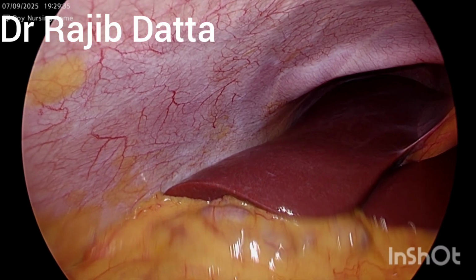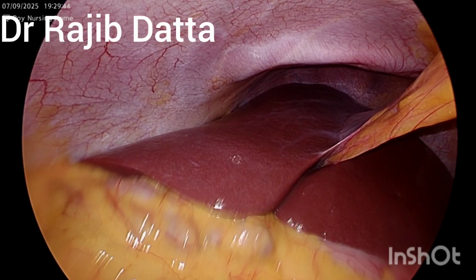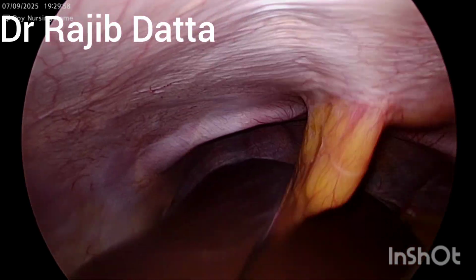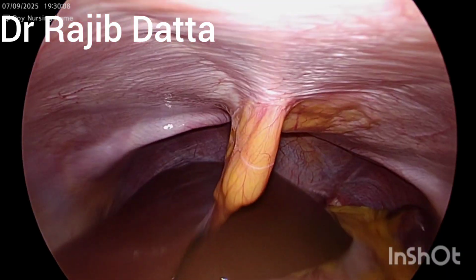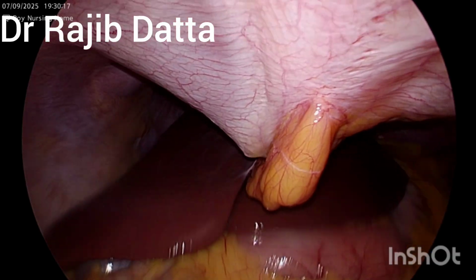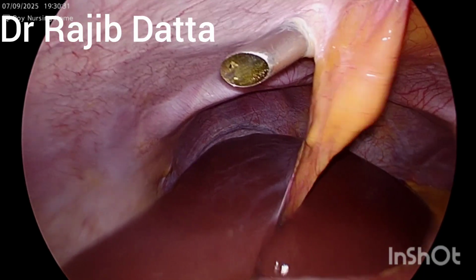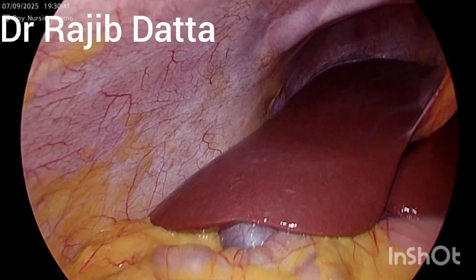is absolutely normal. And now we are going to introduce the mid epigastric 10 mm port. You can appreciate well the falciform ligament through which we are going to introduce the 10 mm port, and another we will introduce a 5 mm mid clavicular port, and this is our 3-port cholecystectomy. So the 10 mm mid epigastric port has been introduced, and now you can appreciate the fundus of the gallbladder that is well visualized here.